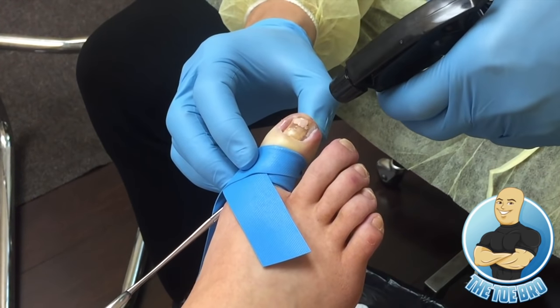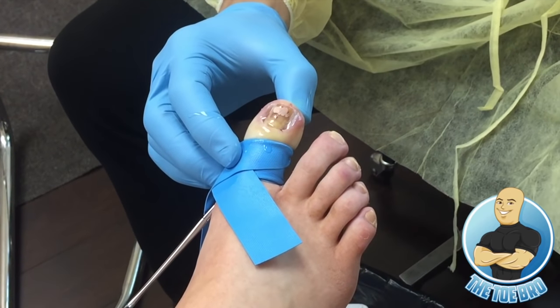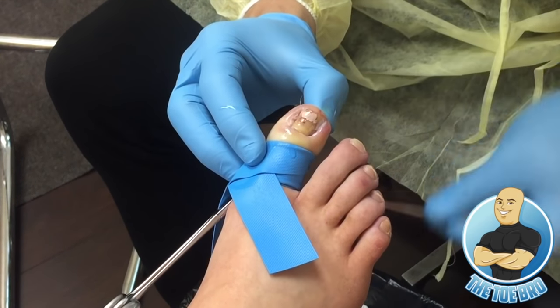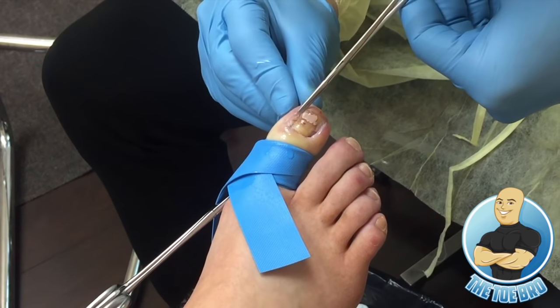Appropriate amount of acid for the appropriate time. I'm using rubbing alcohol or isopropyl alcohol to neutralize this acid. This is going to stop any further reaction to the acid. I'm using more cotton tips to dry out the area, clear it out.